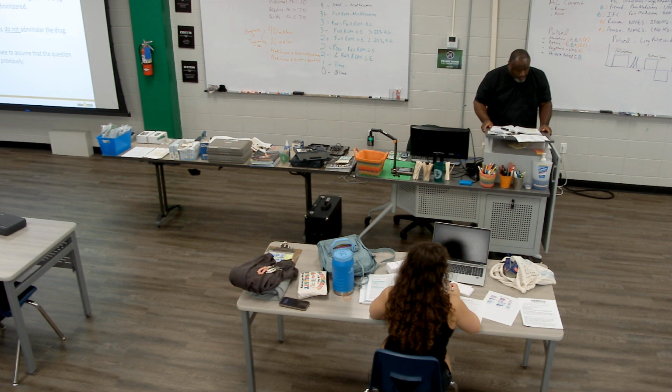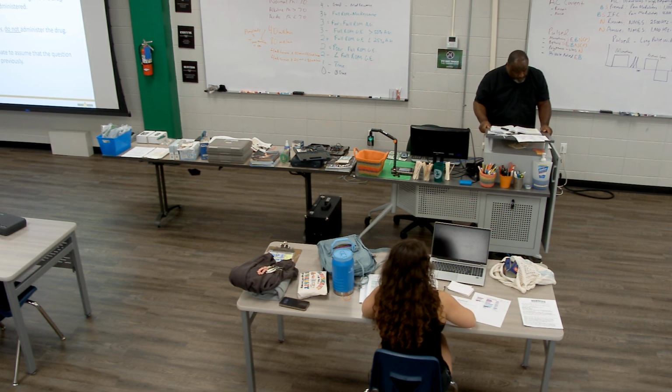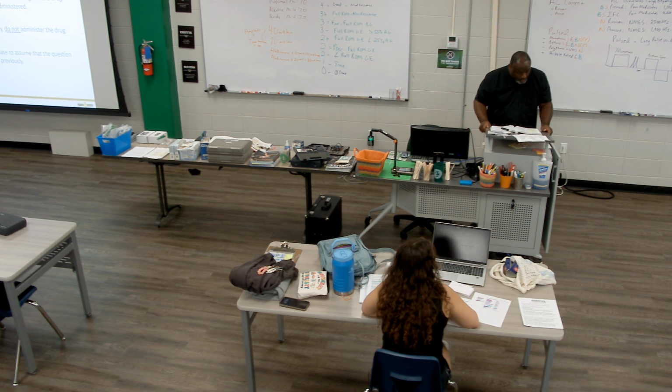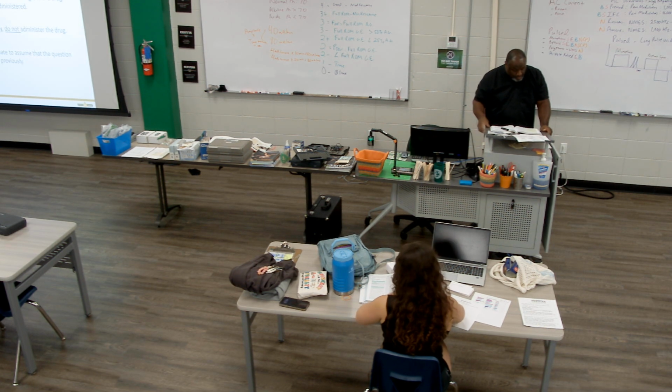All right, so saturating the delivery electrode results in the surface electrode transferring the current with minimal density. Then number 3, the clinician should determine the polarity of the drug. Make sure we understand that, and then place it where it should belong. Once the charge of the drug is determined, the appropriate electrode from the battery source should be attached, whether the cathode for anionic drugs or the anode for cationic drugs.